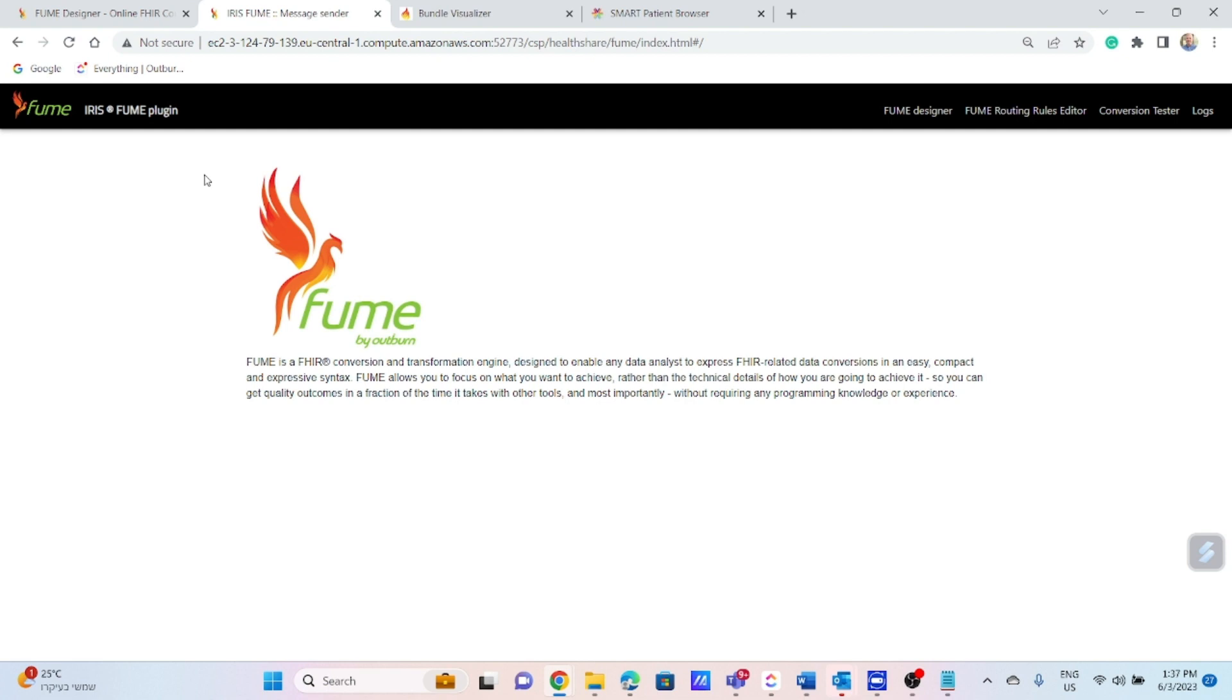The Iris production is based on the following models. Iris business service, which is responsible for accepting incoming messages. Iris business process, manages the FUME engine calls and FHIR resources store process. And two business operations. One of them is responsible for calling the FUME engine. And the second one is for performing RESTful operations against the FHIR Iris repository.